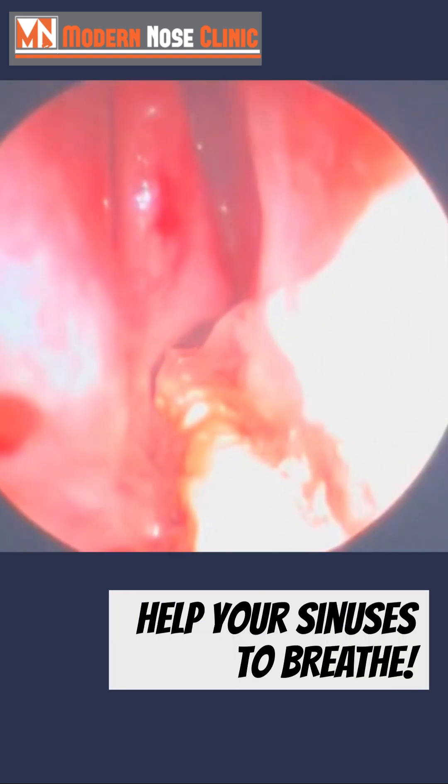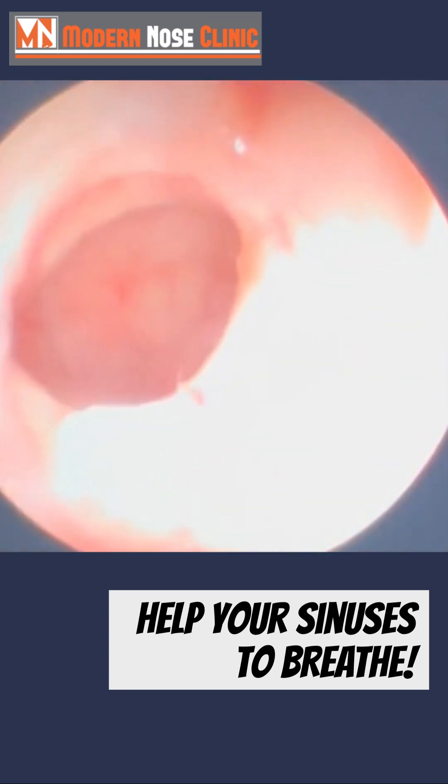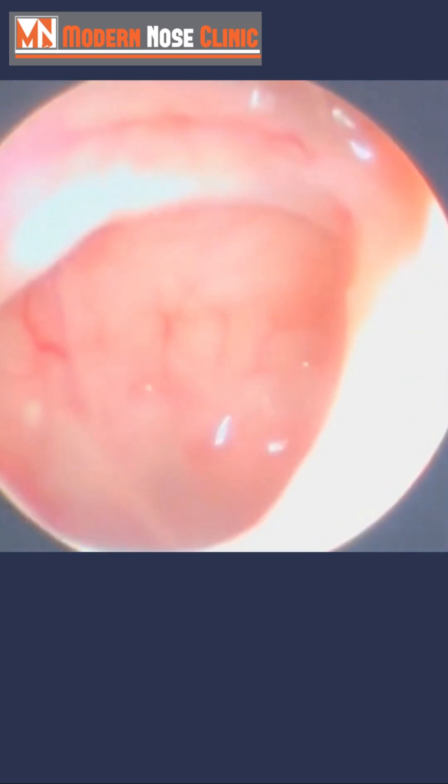Go ahead and inflate. She can hear noises louder than we can, and she can feel some pressure. And that is now opened — look at that, it's well opened. Then we can go in here and suction this infection out.